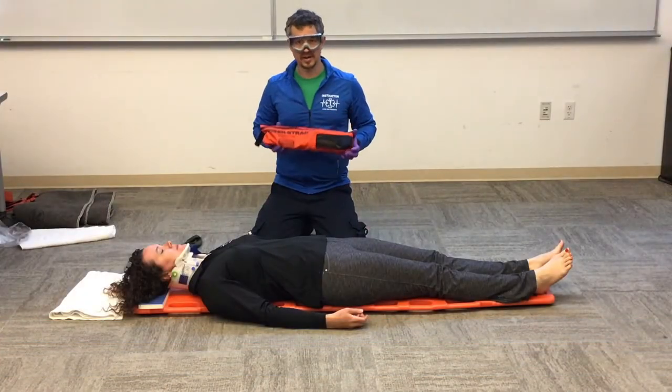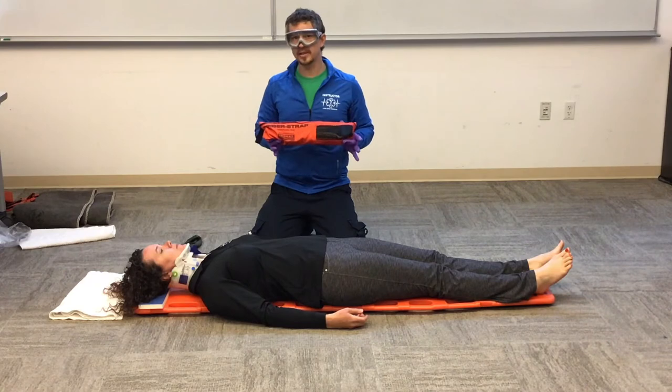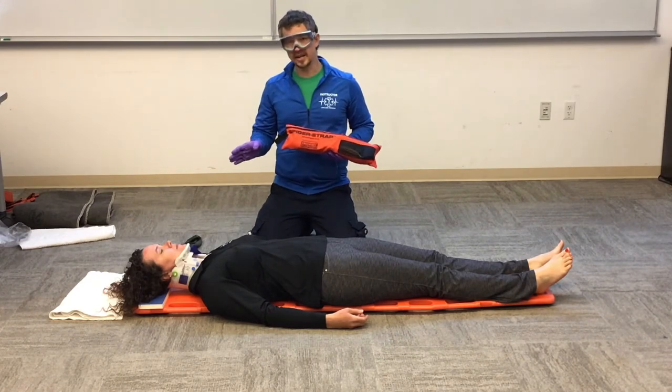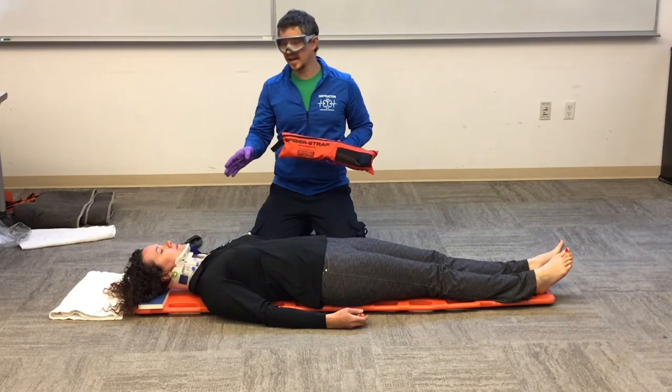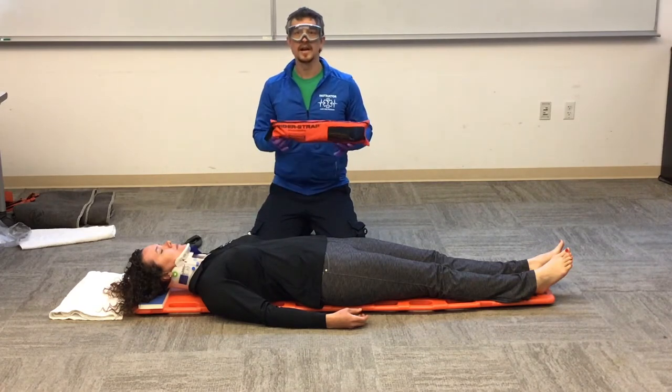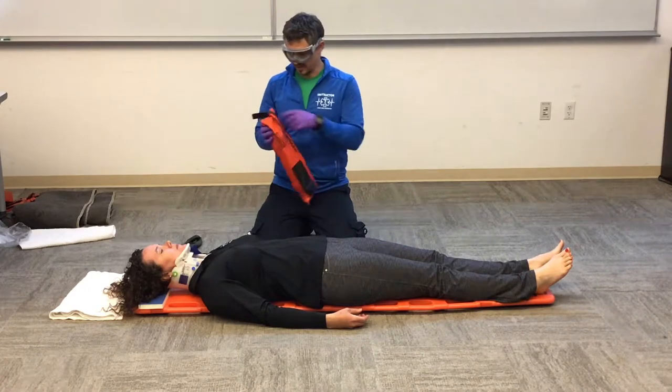We're going to show you our spider strap and how it is different from our buckle strap. We've already taken care of manual stabilization of the head in the neutral inline position, our CMS and C collar, and now we're going to show you the spider strap.